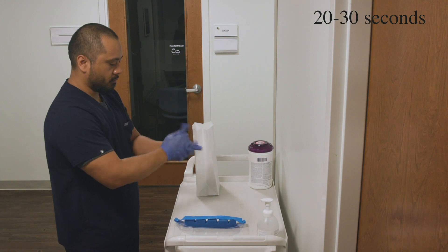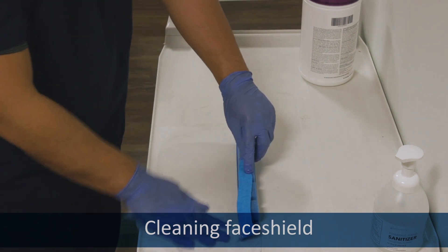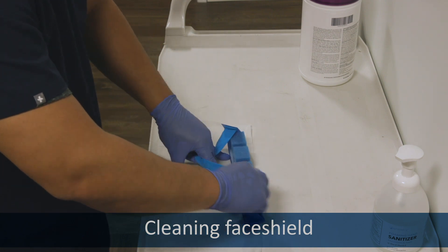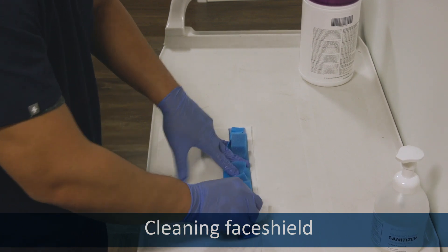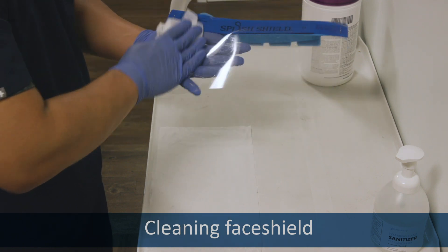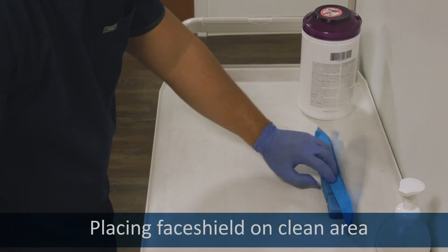To conserve, clean them with the wipe that you set them on. Wipe the face shield thoroughly on both sides. Lay it down in the area designated as clean.